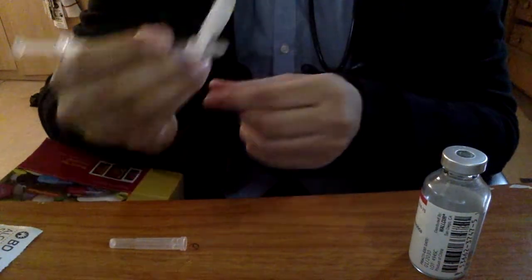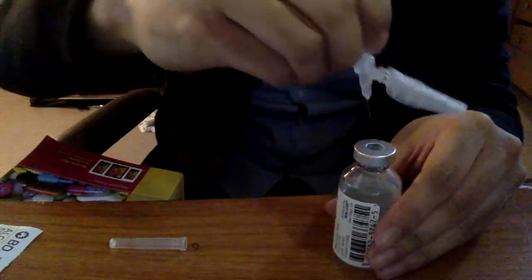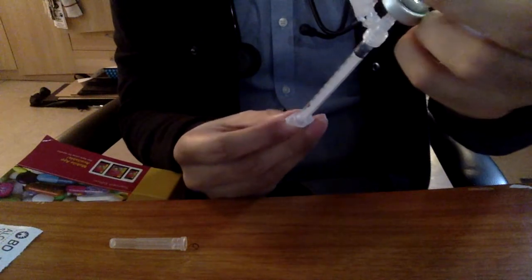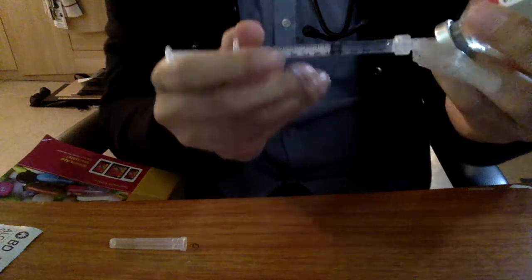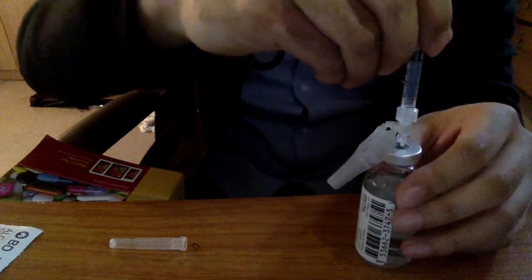Okay. We're going to hold this like a dart. We're going to insert the syringe on the top of the seal of the vial. Okay. We're going to expel the air. We're going to invert the vial, and we're going to draw out 4 units. Okay. I'm going to lift this off the vial.